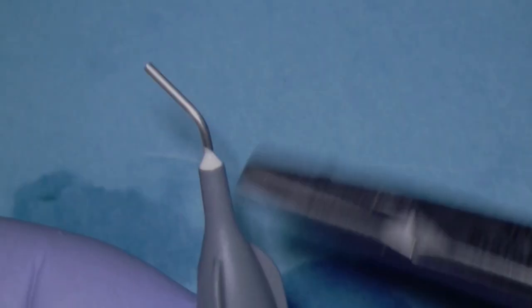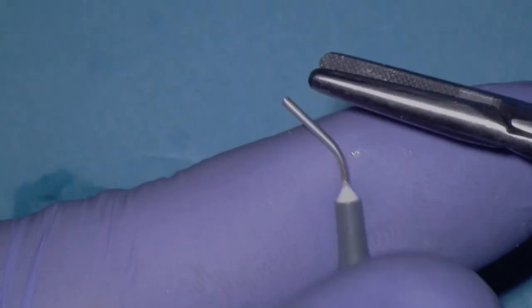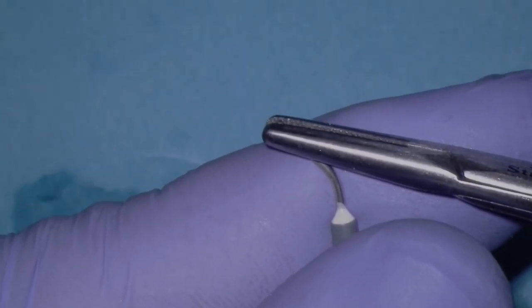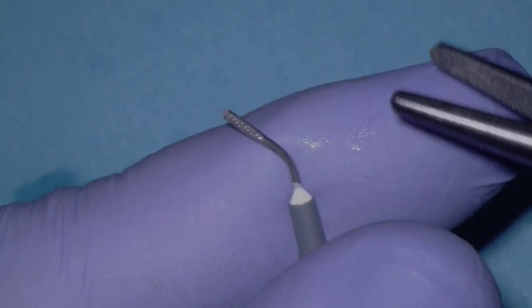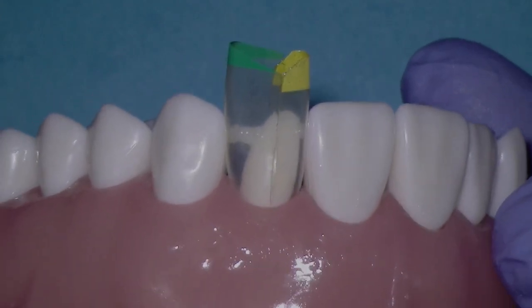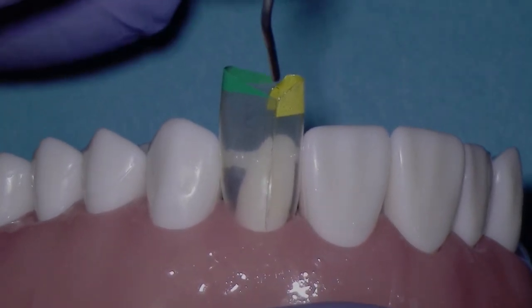Next, we come in with the heated flowable composite. Let's go ahead and bend the tip of the heated flowable. I'll show you this one more time. The bent cannula is much easier to get into small areas. So here we go. I'm going to come in and do the most challenging area first, where this embrasure is very narrow.